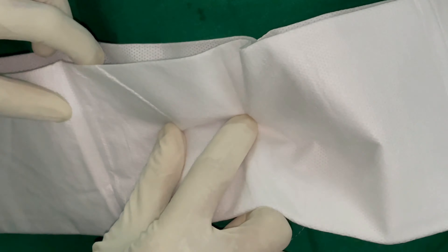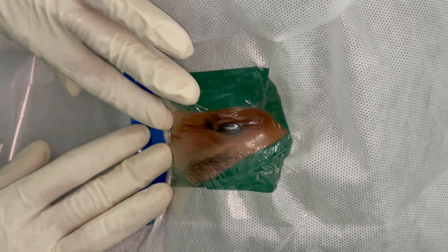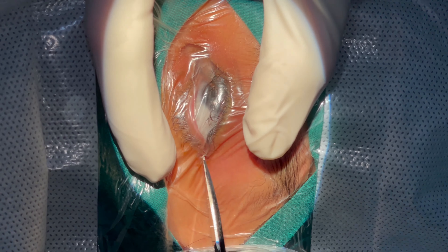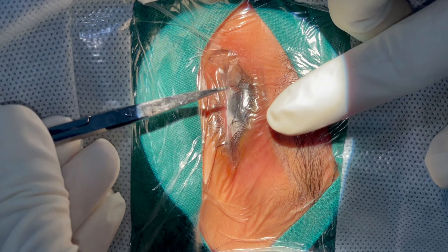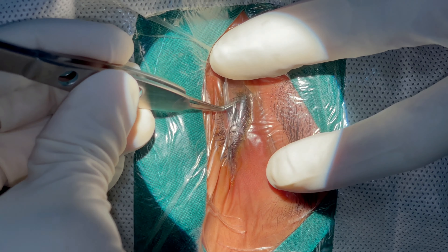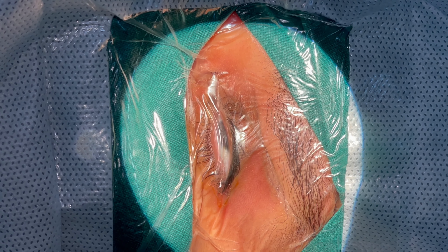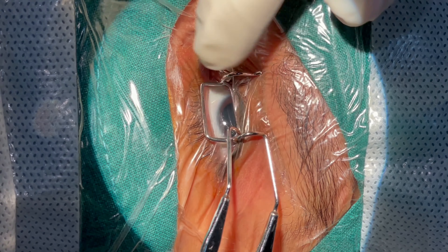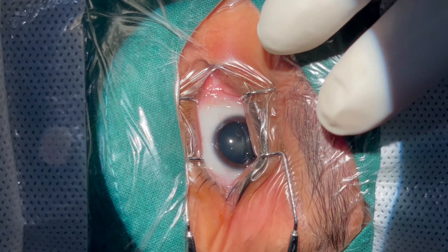The assistant opens out the eyes while the surgeon puts on the drape carefully in the manner described earlier. The poly drape is then cut down its middle. Sometimes when lashes are turning downwards, the use of forceps and sweeping them along will get the lashes to move away under the drape. This is then followed by introduction and opening of the speculum to give adequate exposure.